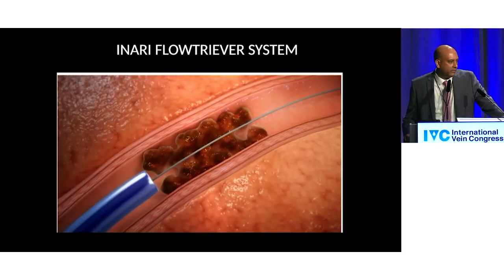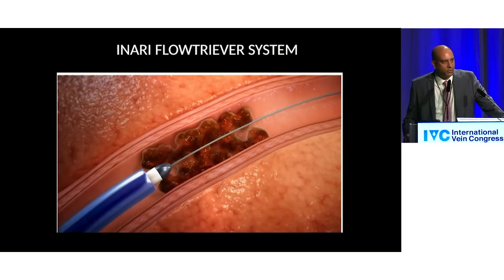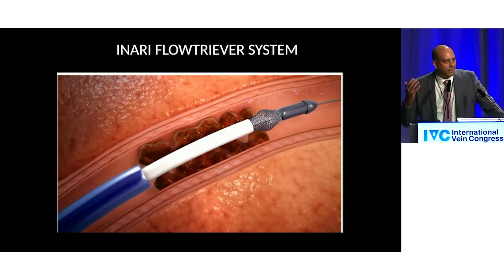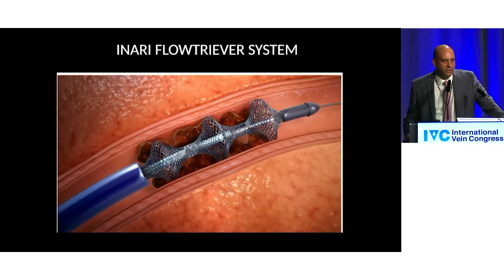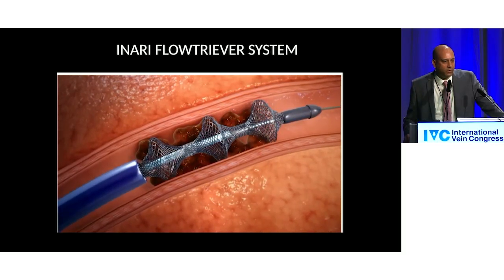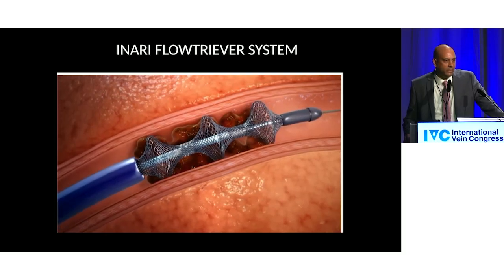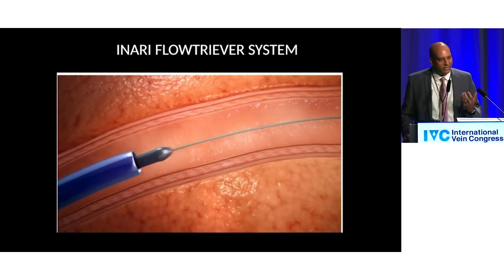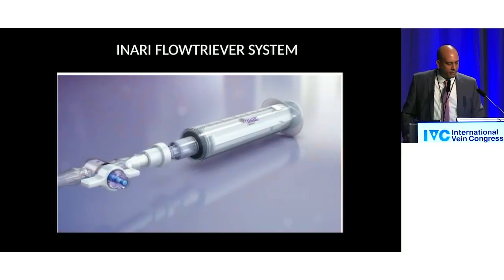And so now here you can see that these are where you can use some of the more advanced devices, where you're basically, think a la stroke therapy, right? Some of the similar devices that we have to treat acute stroke, you now have available not only in the DVT space, but you have it in the PE space as well. And now this lets you pull out more organized clot and thrombus and so forth.